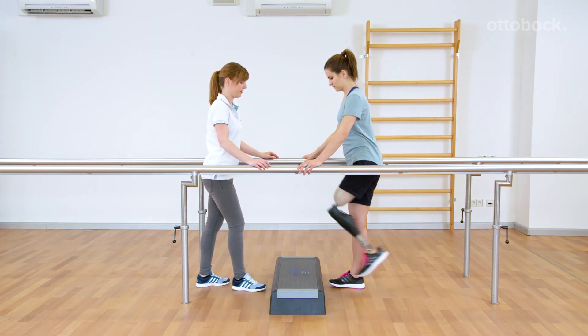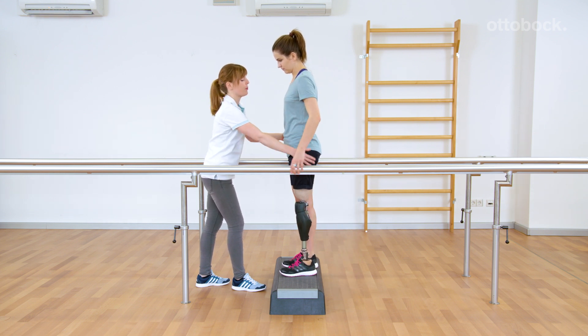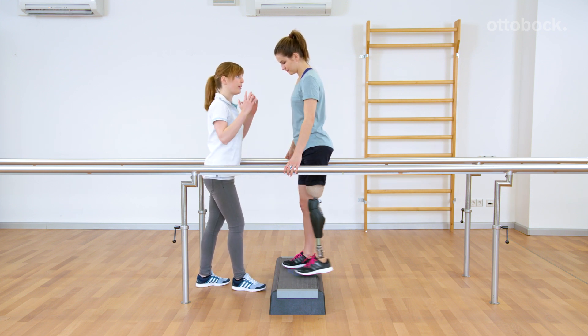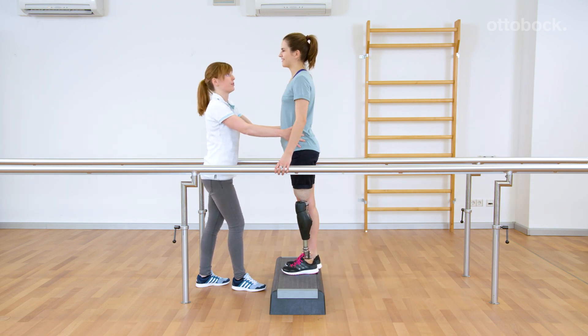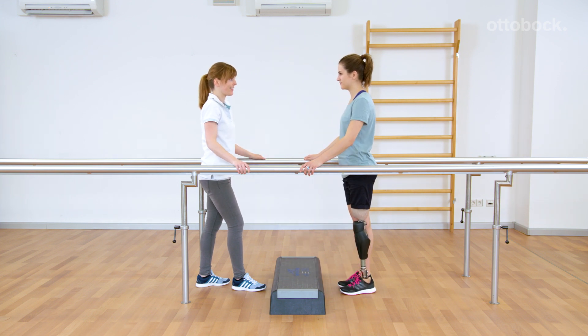Focus on foot placement once the user is able to consistently trigger the movement pattern. The foot should fully contact the stair, which makes it easier for the user to step up. The torso has to move forward and up so that it is easier for the user to actively extend the residual limb when stepping up.